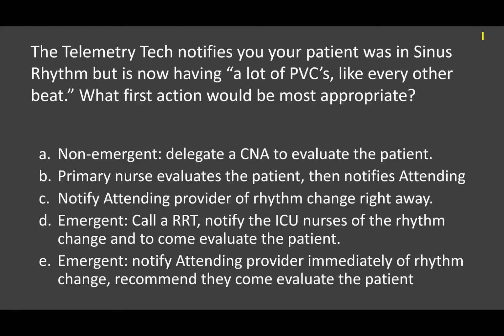The telemetry tech notifies you your patient was in sinus rhythm, but is now having a lot of PVCs, like every other beat. What first action would be most appropriate? Well, you have to decide, are PVCs important right now? The hallmark of this is that it's an increased frequency, and it's a high frequency as well. And that makes it new and unique. And if you recall, the thing that makes PVCs dangerous is that the more often they're happening, the more it can affect the patient.